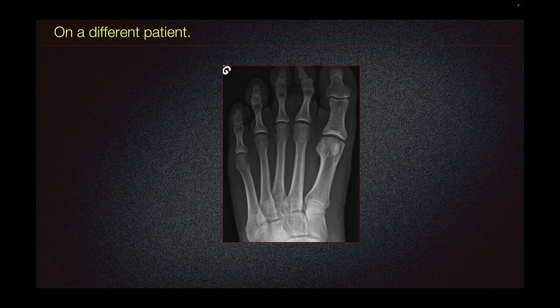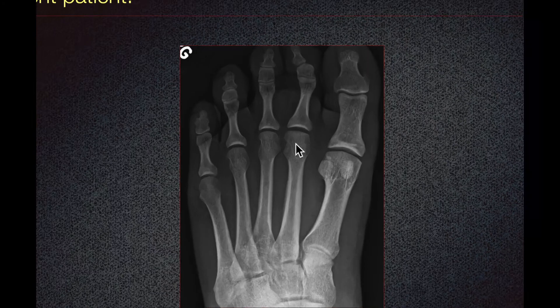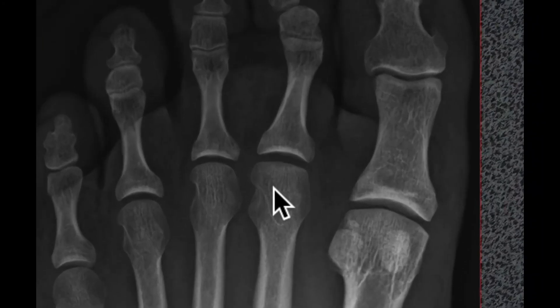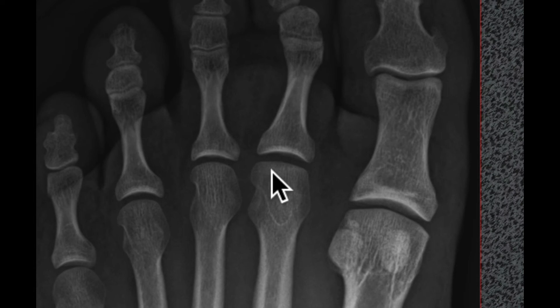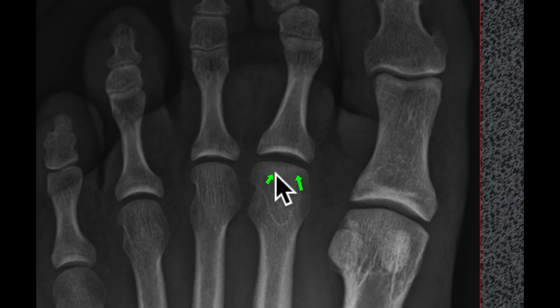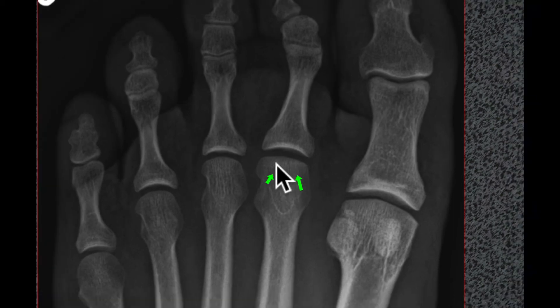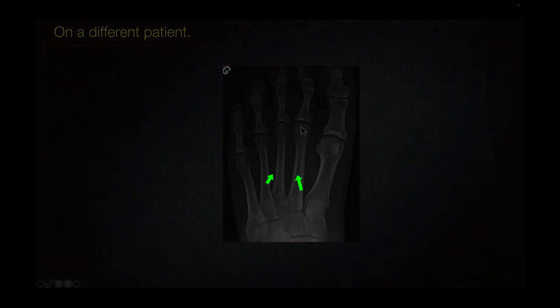This is a different patient showing a flattened second metatarsal head with subtle subchondral sclerosis, typical of osteochondrosis involving the second metatarsal head.